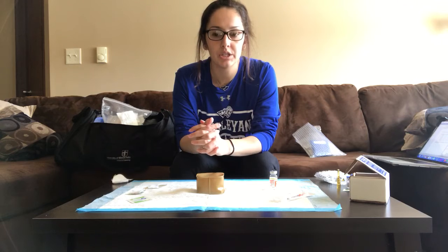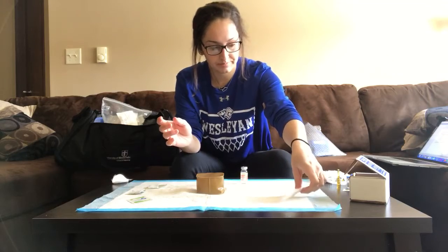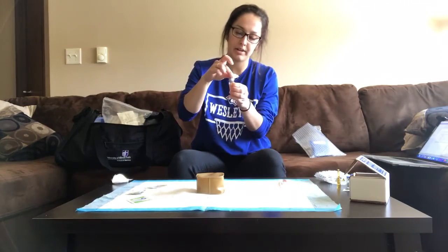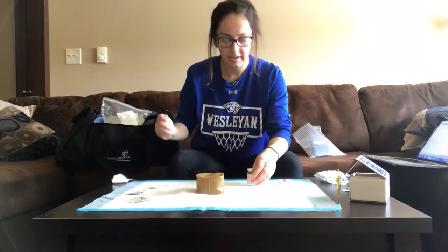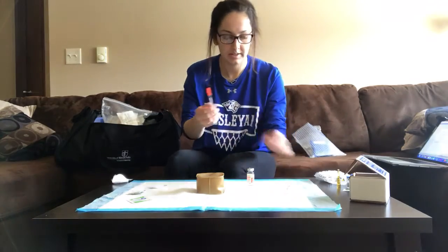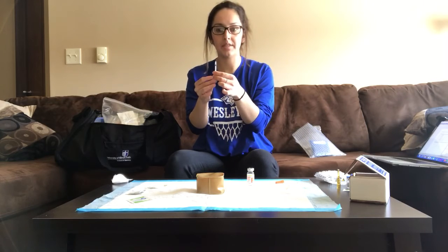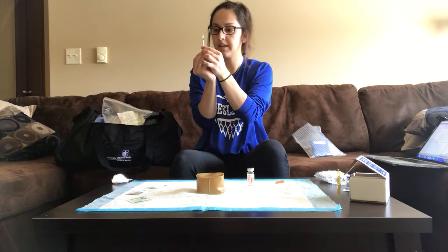I'm going to then start to withdraw my medication. So I'm going to use an alcohol swab. I'm going to cleanse the top of the vial, on the rubber part, the whole top, for 15 seconds. And then I am going to pressurize the vial. So I'm going to take this off. And then since I have to administer 9 units of insulin, I'm going to pressurize the vial with 9 units of air.